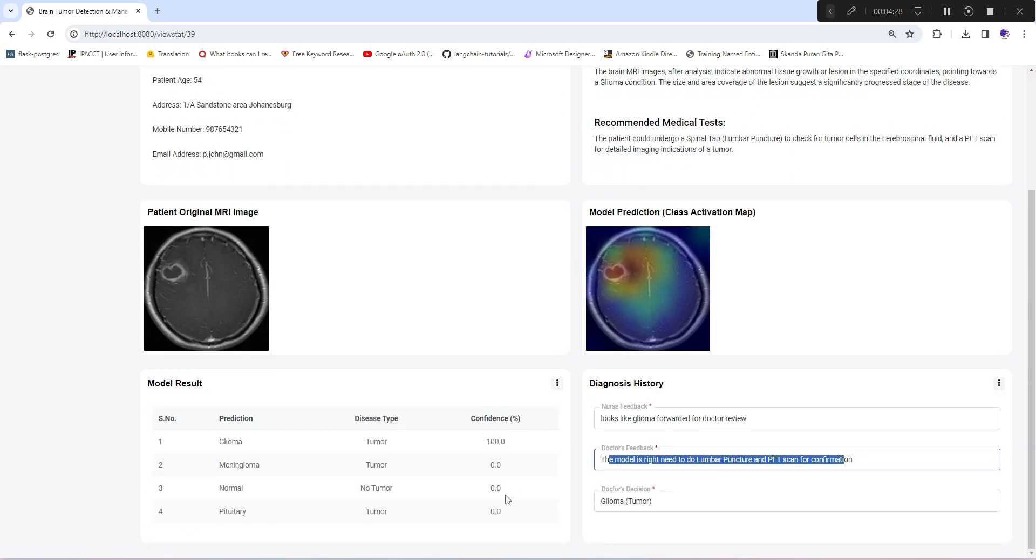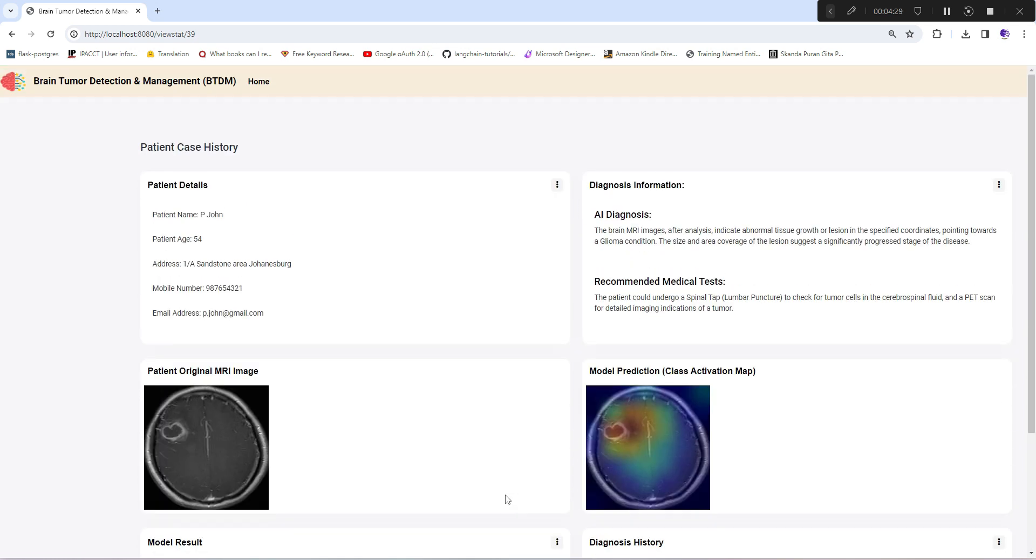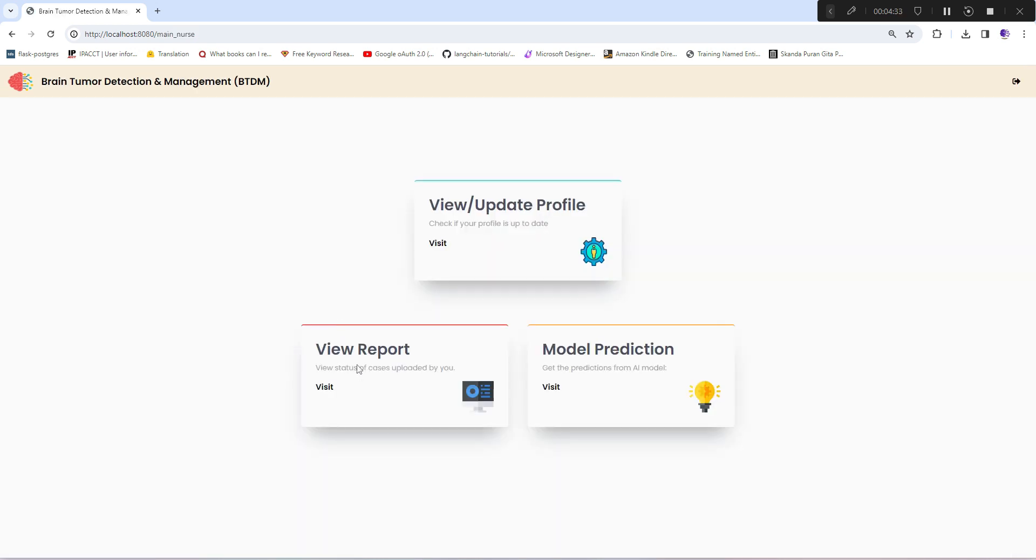Now I'll quickly go to model prediction section where I can show you the complete cycle - how she can upload the image, then it will go to the doctor's panel, and later I'll show you the admin panel as well.